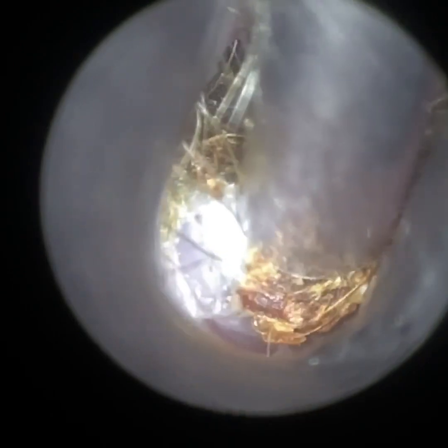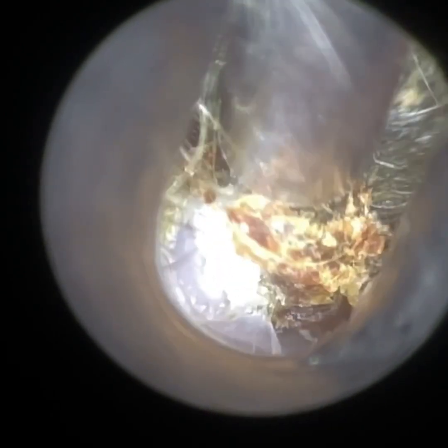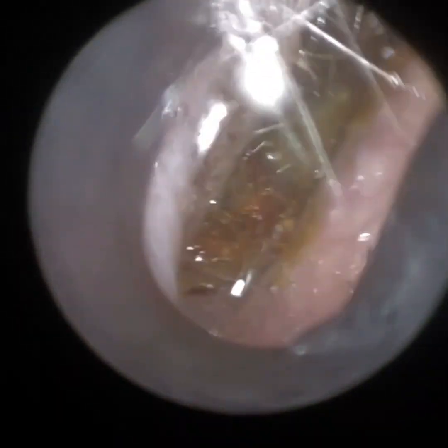That is the case with this ear — so in terms of height, there is quite a lot of space, but in terms of width, there's very little space to play with. In fact, this patient got referred to me by another audiologist who struggled to gain access into the ear.